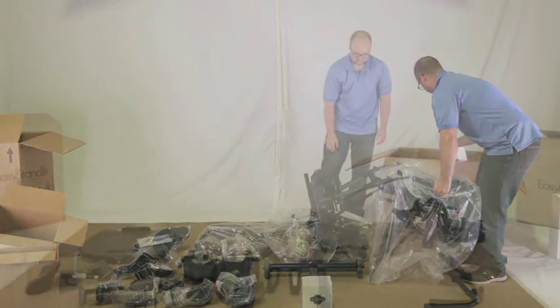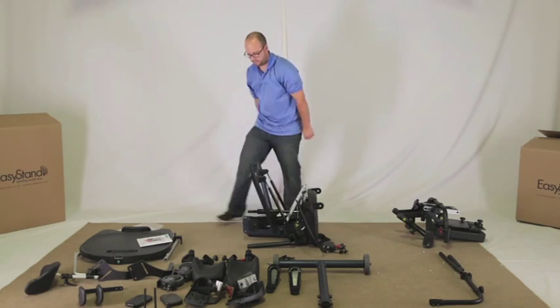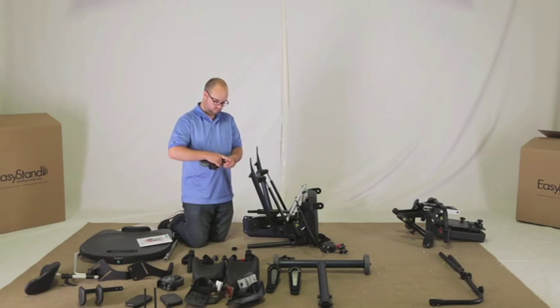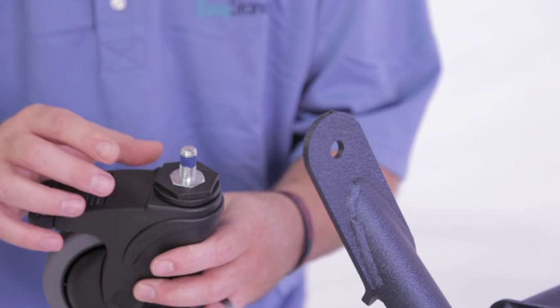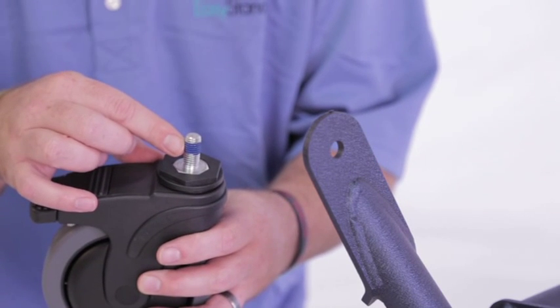Position the base of the unit as shown to install the casters onto the base. Remove the hardware from the casters. The casters are supplied with a locking component pre-applied to the thread stem.